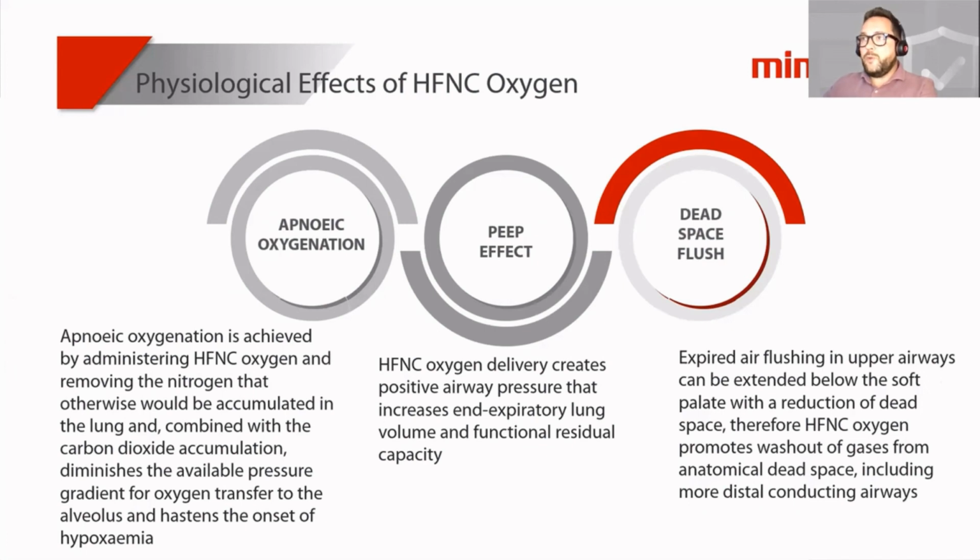Also, this high flow promotes a reduction of the dead space by washing out the gases stored there, including those in the more distal airways. This is the dead space flush.